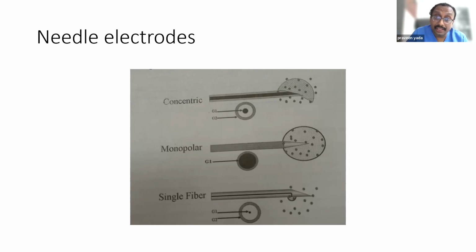Second, another important thing is that this can be very painful. And for some reason, some muscles are very painful. So we know which is the last muscle that should be tested. And the last muscle normally is the APB, and the ADM. Because they are very painful, normally we try to test them last. In fact, the funny thing is that FDI is not so painful when tested, but APB is very painful, and we should keep it in our mind that we'll test the APB last, because after that we know the patient won't allow. Therefore, as much as it's a skill, it is a tact.